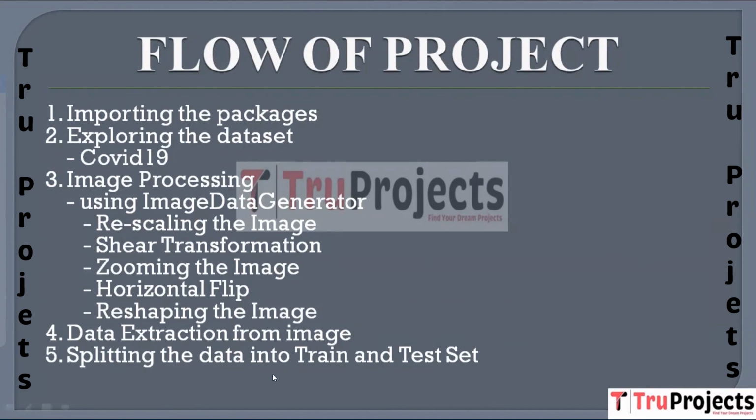Then next, here we have splitting the data into train and test set. The dataset is typically divided into a training set and a testing set. The training set is used to train your machine learning model, while the testing set is used to evaluate its performance. The split helps in assessing how well your model generalizes to new unseen data.